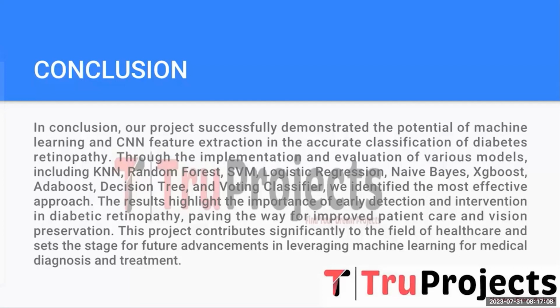The results highlight the importance of early detection and intervention in diabetic retinopathy, paving the way for improved patient care and vision preservation. And this project contributes significantly to the field of healthcare and sets the stage for future advancement in leveraging machine learning for medical diagnosis and treatment.